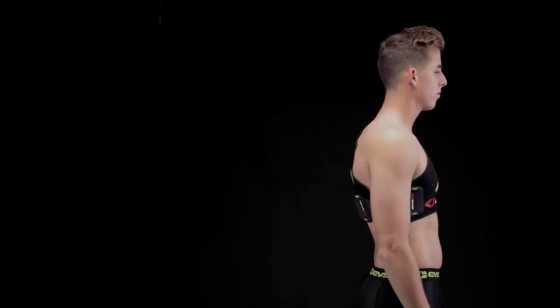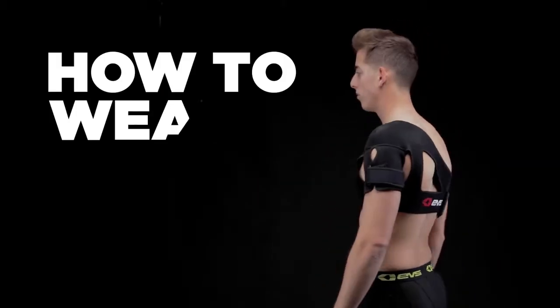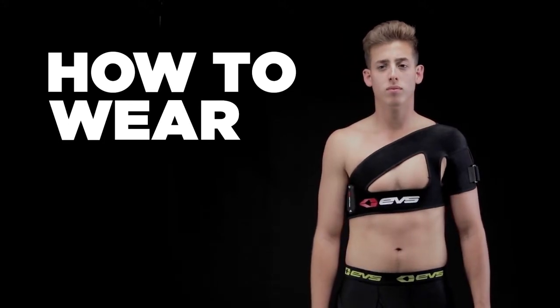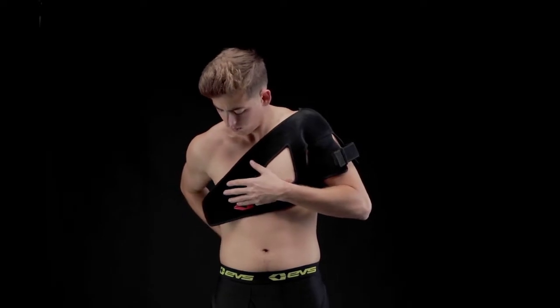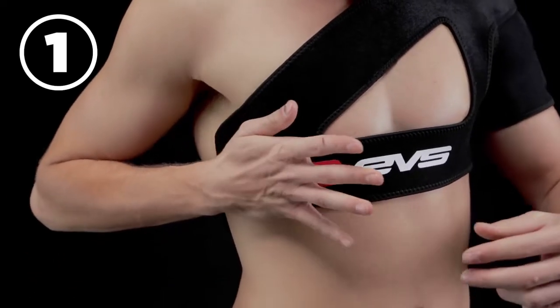To get the maximum benefits, proper fit is important. First, slide your arm through the armhole and attach the Easy Grab front closure to your desired tightness.